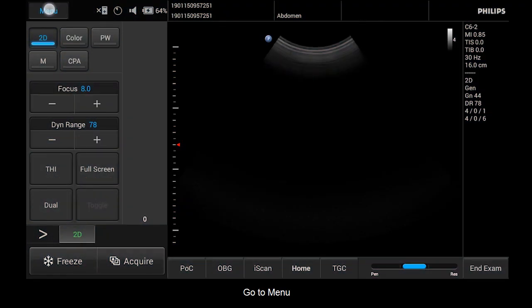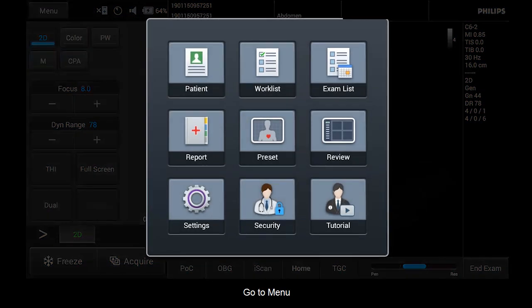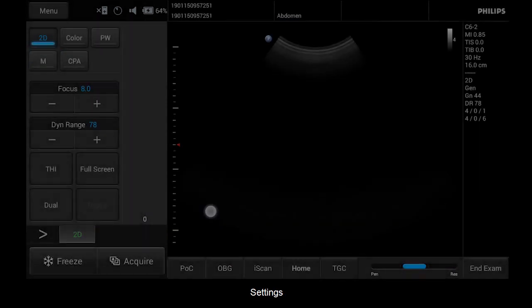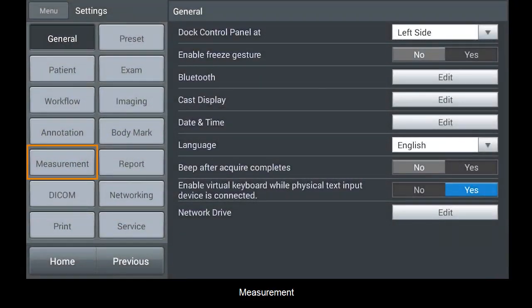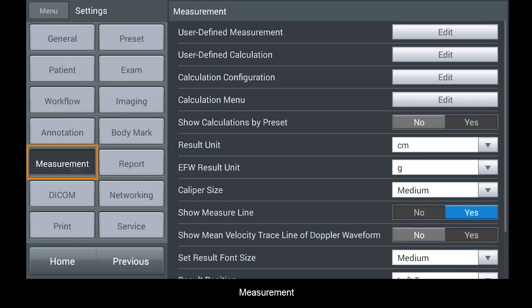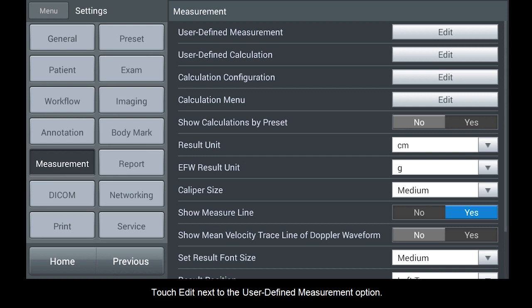Go to Menu, Settings, Measurement. Touch Edit next to the User Defined Measurement option.